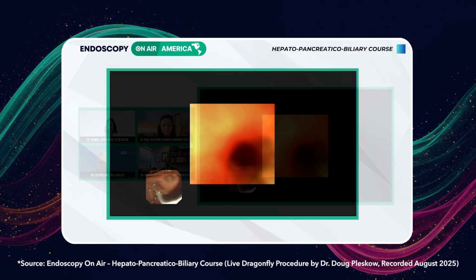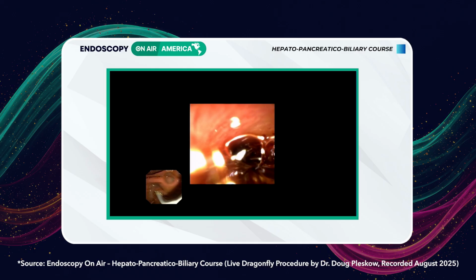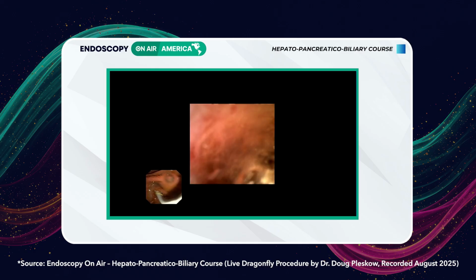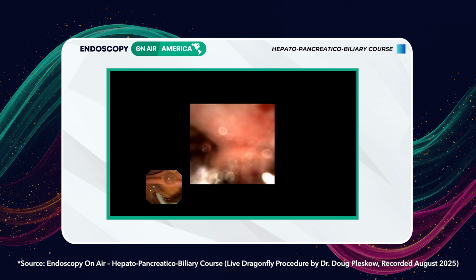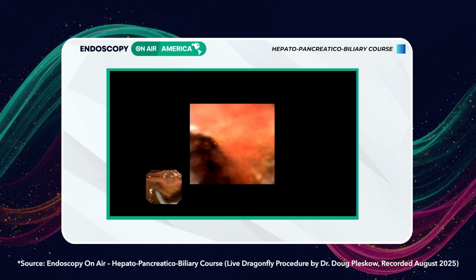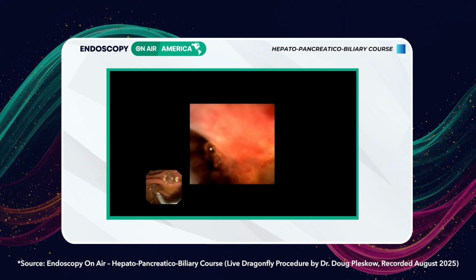Big? Yeah, let's make that big. Okay, so we have the guide wire out. So let's go look up a little bit more. We're going to irrigate here. And again, I'm going to rotate using very, very small little motions with my hand, and I can use my wrist a little bit to try and direct the image.